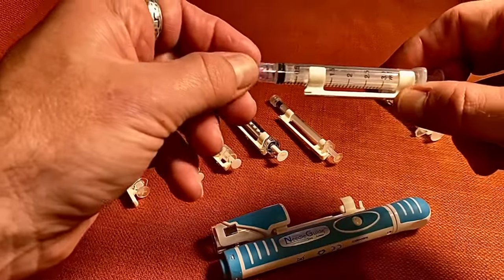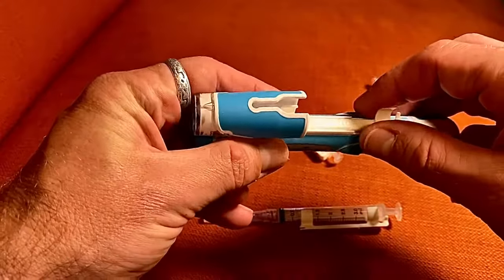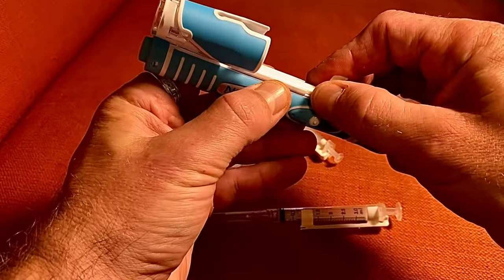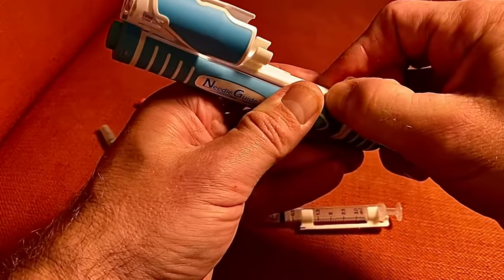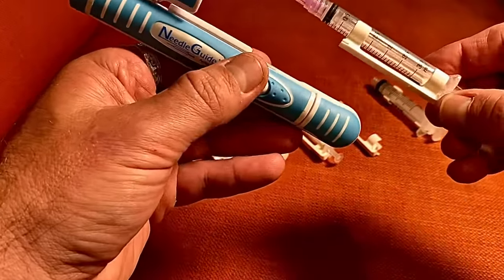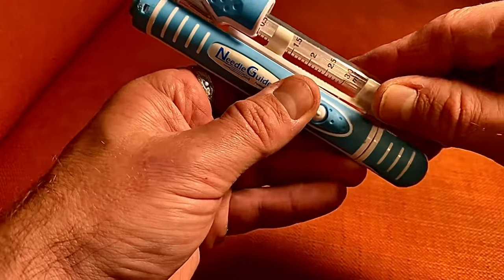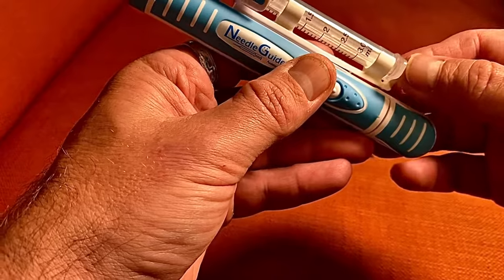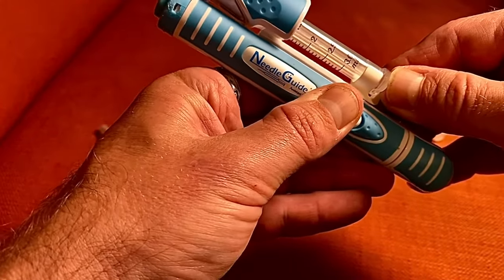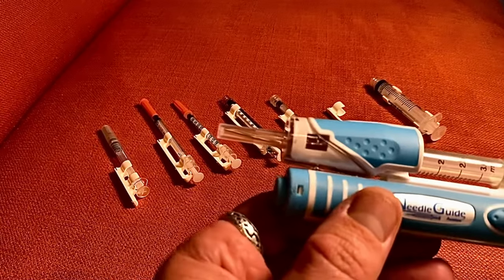If you have a three mil syringe and need to swap out the syringe holder, just hold the back of the device and pull it back. Then take the syringe, put it in there, push it forward, make sure it's in the slot, and that's it.